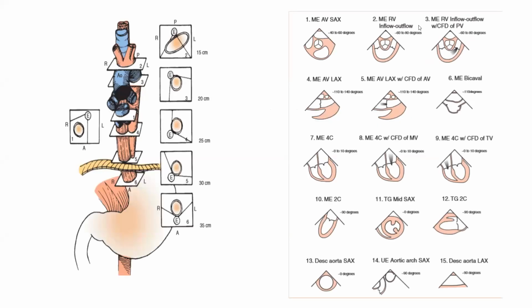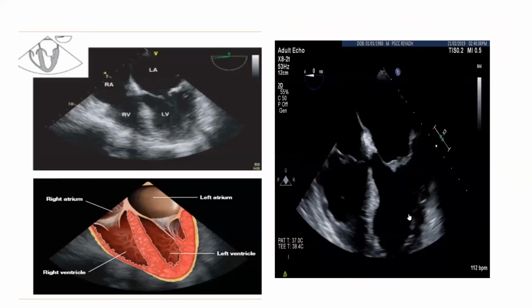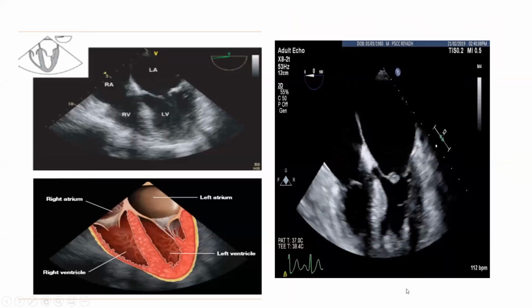Of course, all the views will go through it. We start, as we said, from the mid-esophageal view, then upper esophageal view, and then transgastric view. Three only. Then upper esophageal view, mid-esophageal view, and transgastric view. Go. Start.